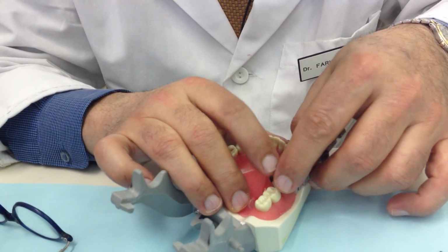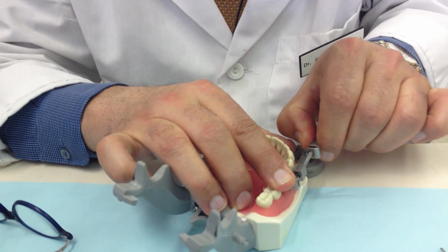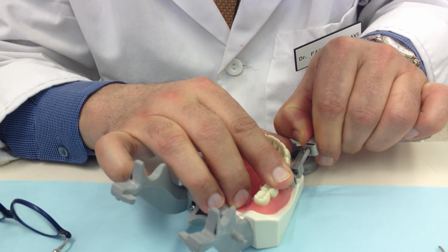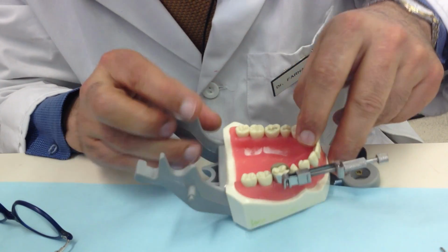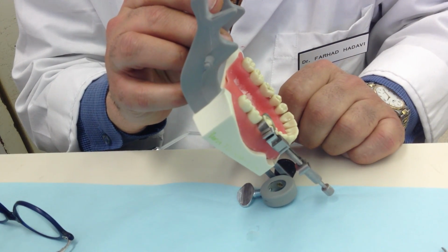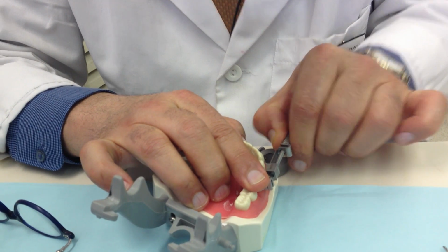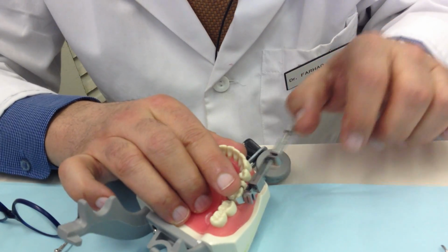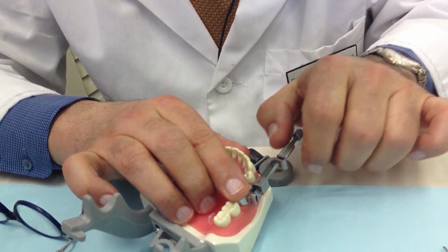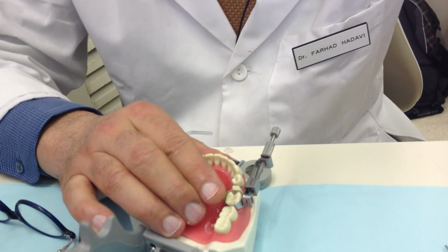I place that one over here. I tighten it as much as possible. Can you see that one? I tighten that one. I check it again. Yeah, this is exactly 1.5 millimeter above the adjacent marginal ridge, correct? I tighten that one. And then I turn it about a quarter round, counterclockwise. That's it. And I'll tell you why.